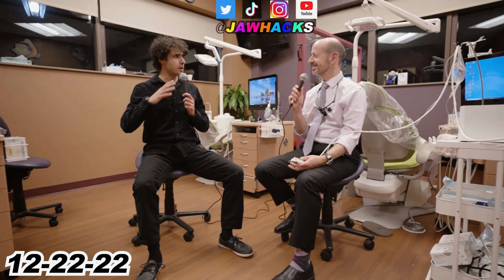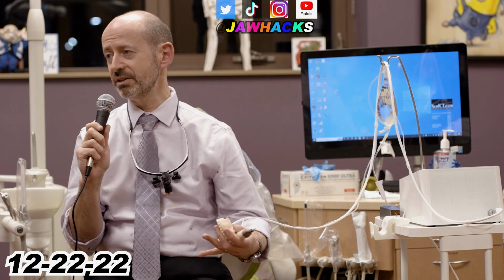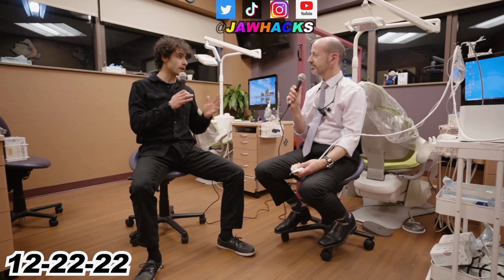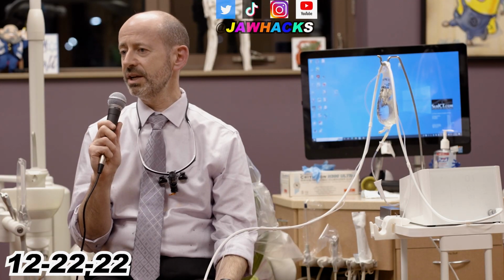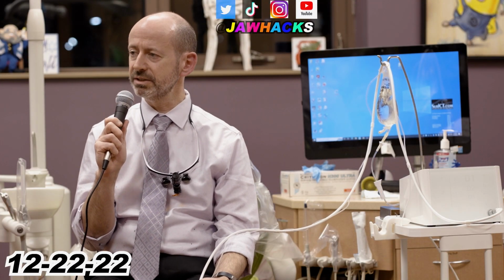Out of roughly how many cases? Not a very fair question because it's close to over 150, but not all of them are adults or adult males. Maybe a good third of them. And are you using this even on patients who aren't adult males, let's say, on younger patients or female patients? My cutoff, I would say anyone over 25 will get it done. Males 25 and females around 30+. So this tool has basically taken one of the biggest uncertainties with MSE treatment and eliminated it.